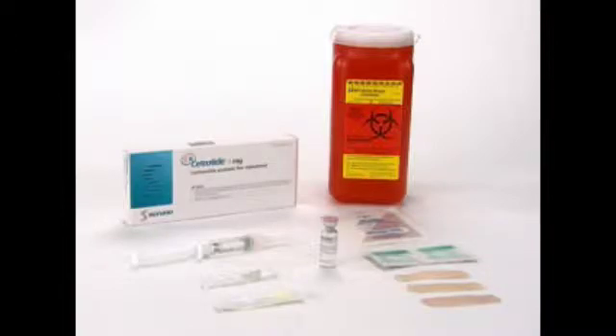You will also need one gray injection needle, 27 gauge, ½ inch, along with alcohol swabs and a safety container.